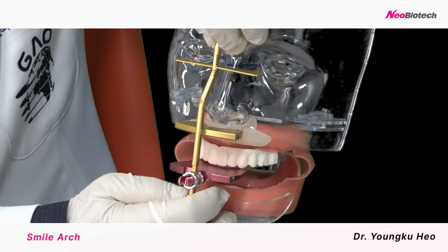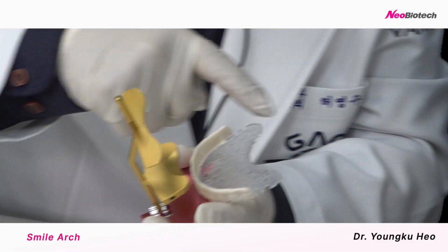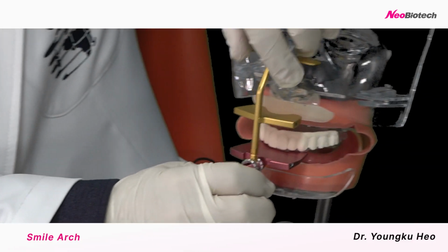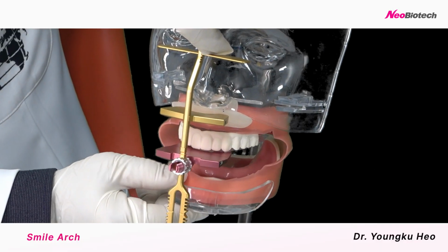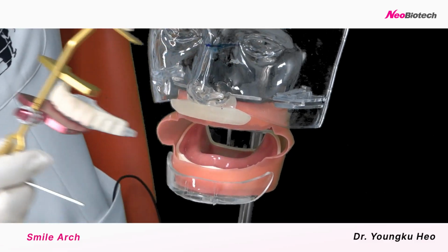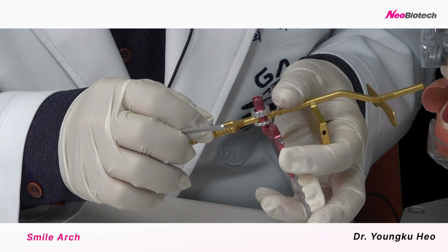So you don't have to be very accurate. And then there's the impression on the upper part. And then we can make the bite registration, the CR record, using this information, because we already know the vertical dimension.